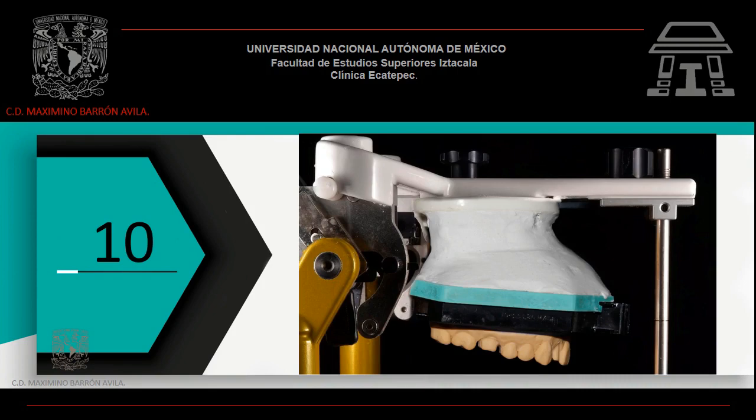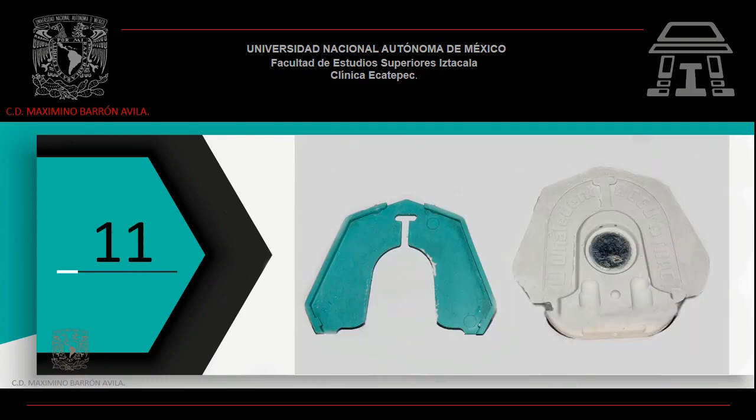Coloca yeso tipo 2 si fuese necesario. Dale forma y deja que el yeso termine su proceso de fraguado. Una vez fraguado el yeso, retira la platina de montaje del articulador. Separa el sistema ACUTRAC y retira el espaciador de goma.